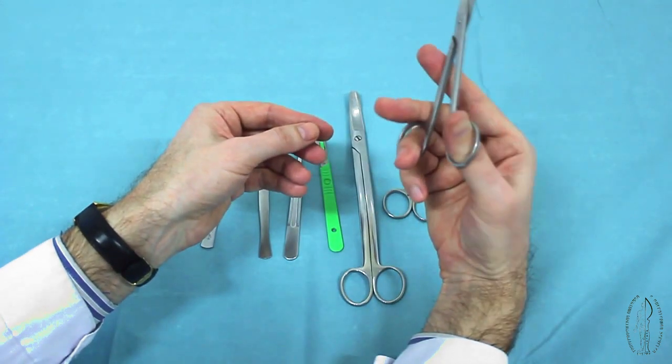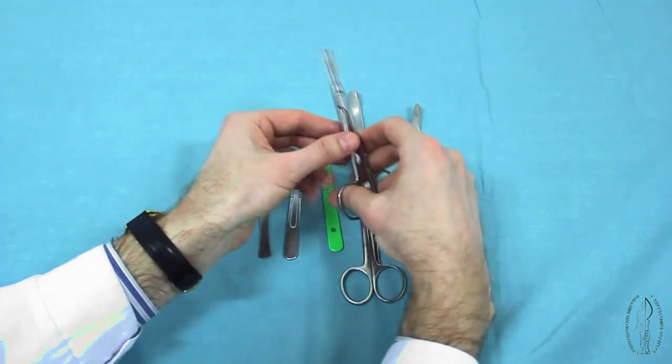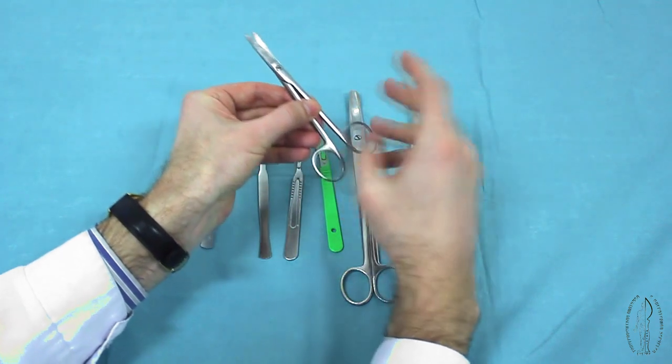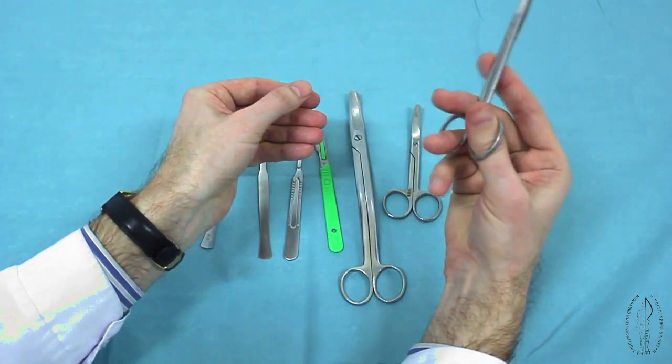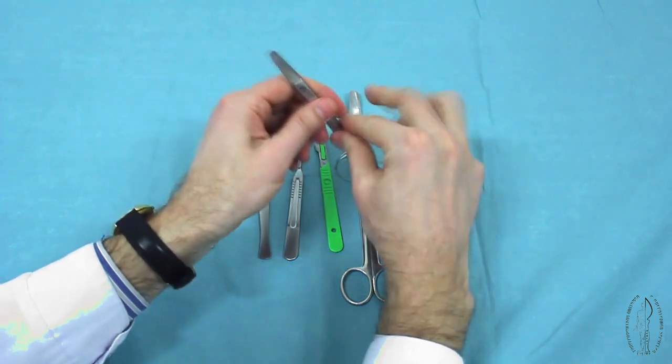The position of scissors in the surgeon's hand should be as follows. The thumb and fourth finger are inserted into the rings of the instrument. The index finger plays the role of a lever.